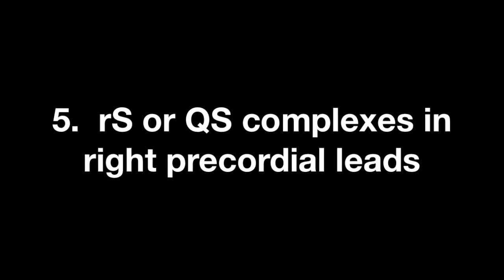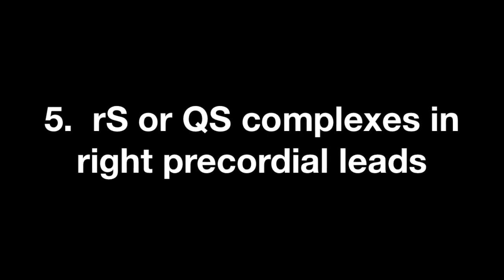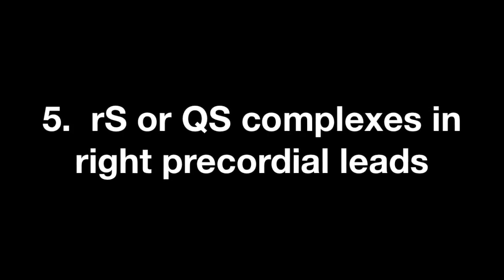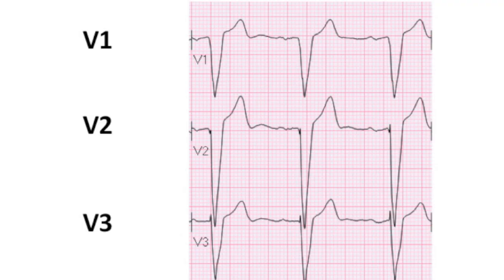The final criteria for the ECG diagnosis of left bundle branch block are the presence of RS or QS complexes in right precordial leads. You will see these in leads V1, V2, and V3. In lead V1, you have a broad QS complex. In V2, depending on the beat, you have a QS or an RS complex. And then finally in V3, you have an RS complex.